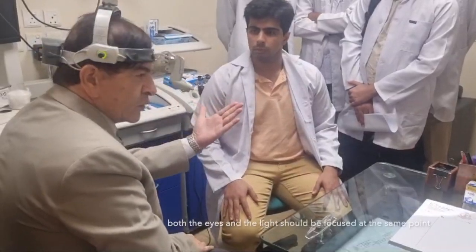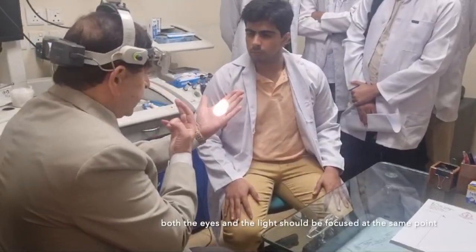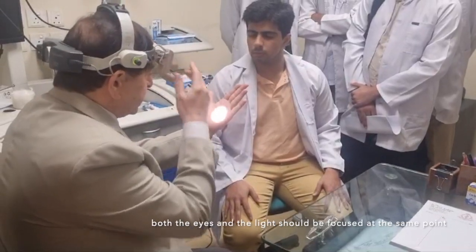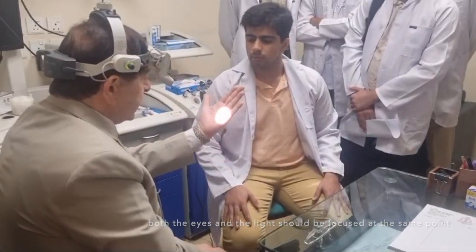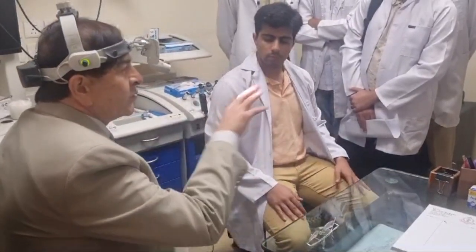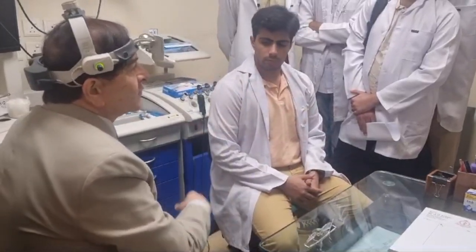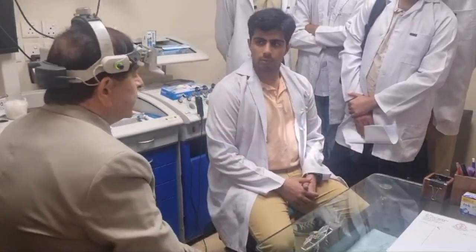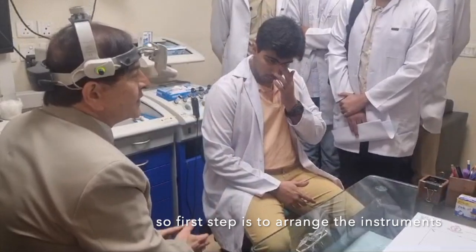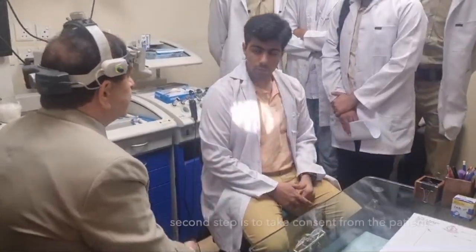Once you move your eyes, both the eyes and the light focus should be at the same point. If it's not at the same point, light will be going somewhere else and you will be looking somewhere else. So the first thing was examine and arrange the instruments, the second was consent.